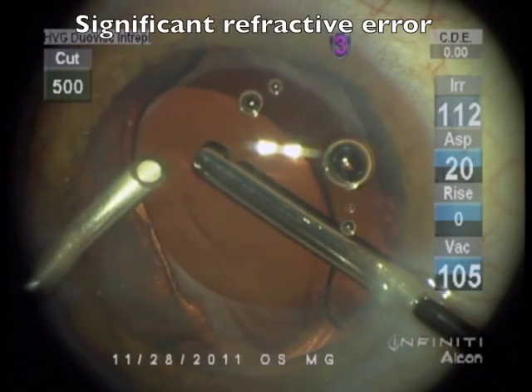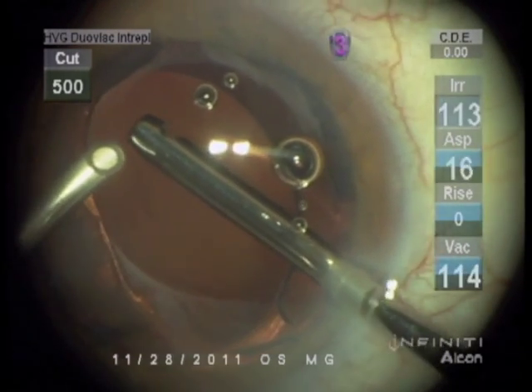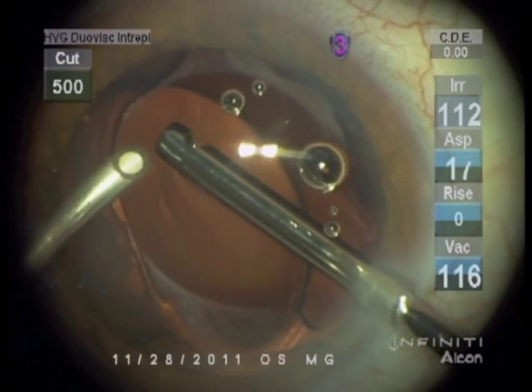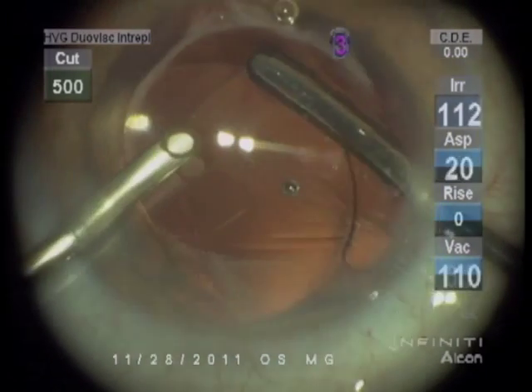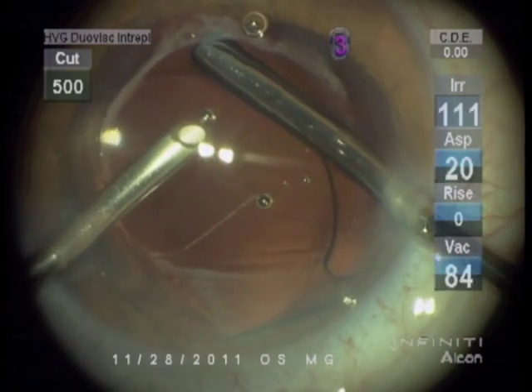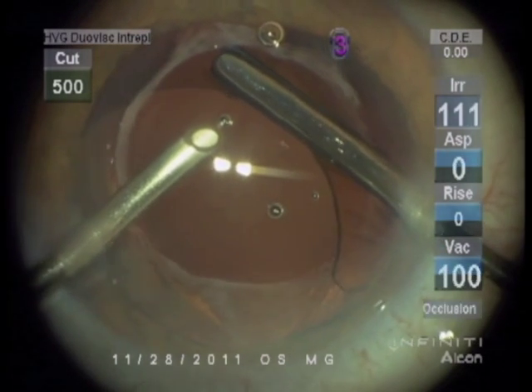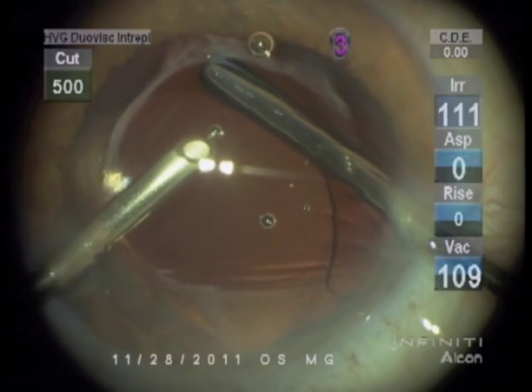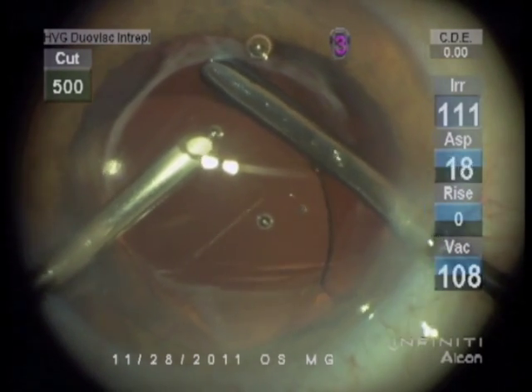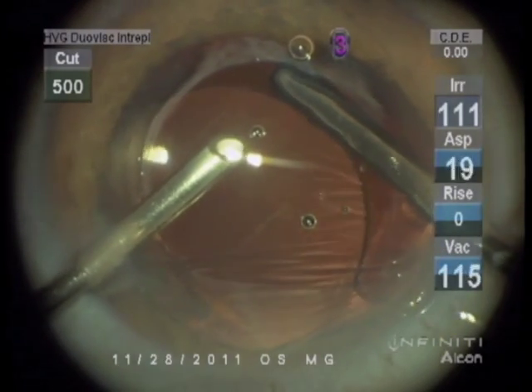A 77-year-old lady who had surgery eight years ago — her lens had one haptic in the bag and the other one was in the vitreous. You can see how it's quivering here when we're doing vitrectomy to remove herniating vitreous. We are sitting superiorly on the left eye, and that inferior temporal haptic is not supported by the capsule.